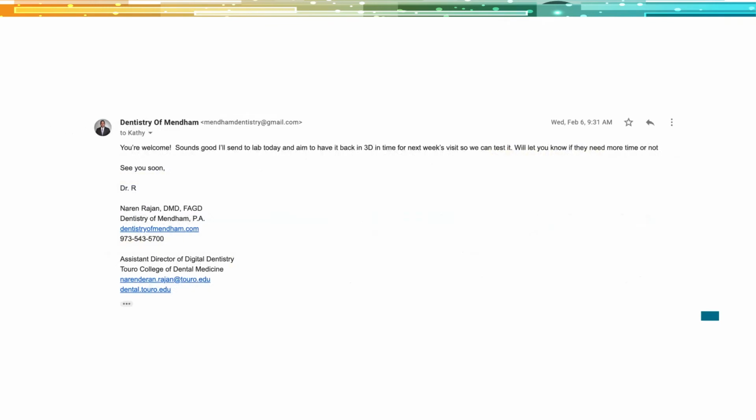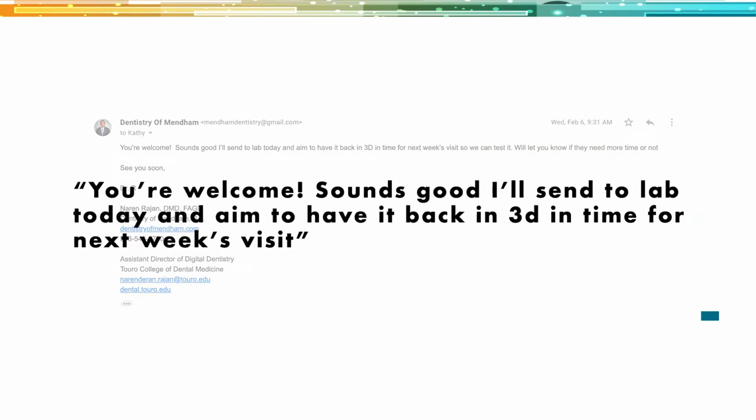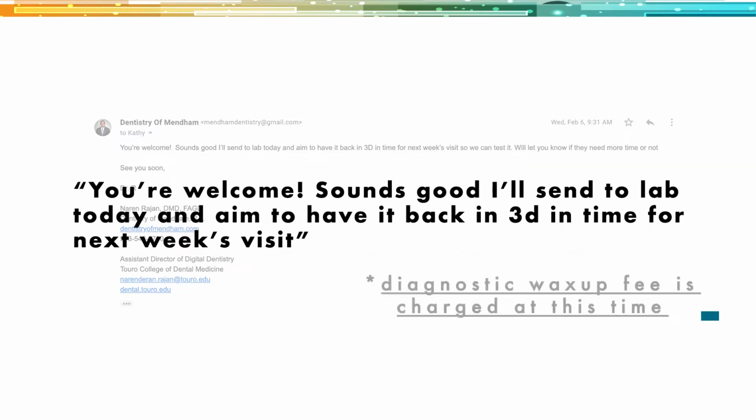And so I wrote back, I said, you're welcome. Sounds good. I'll send to the lab today and aim to have it back in 3D in time for next week's visit. It's at this point that we actually charge a diagnostic wax up fee. To do a live mock-up, we charge $100 per tooth.